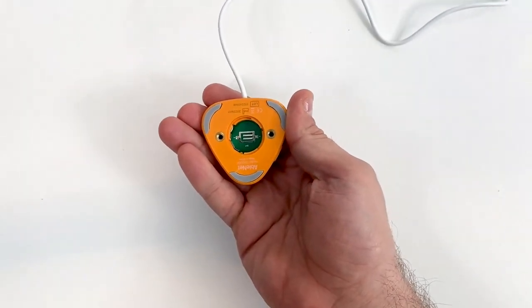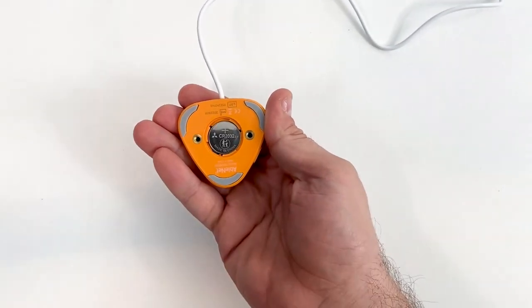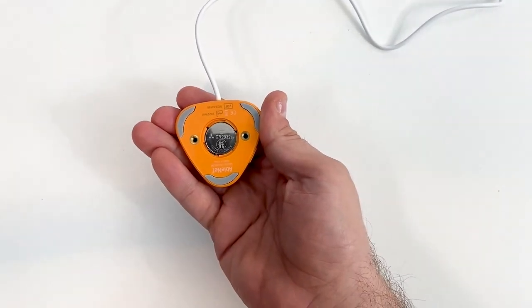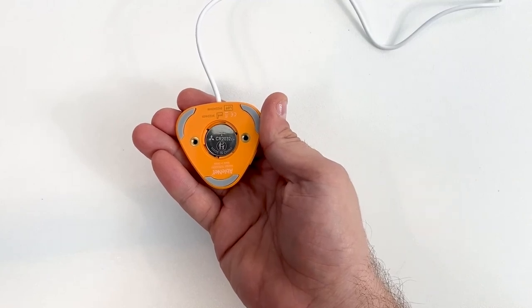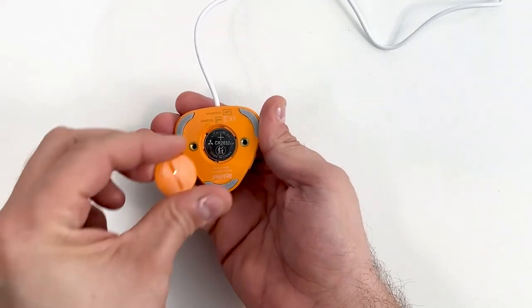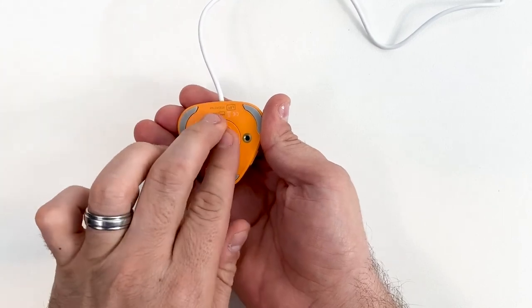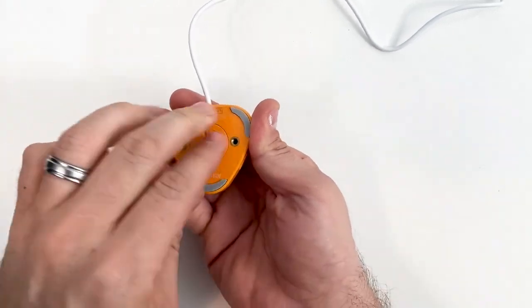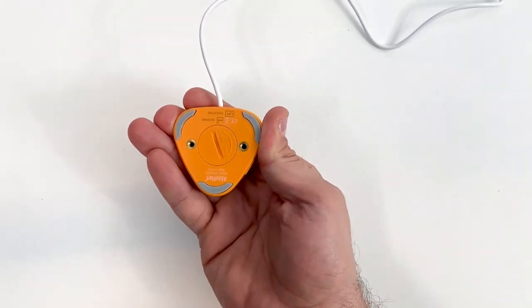Place a new CR2032 battery in the battery compartment with the negative side facing the switch and positive side facing out. Replace the battery cover, then twist counterclockwise until it stops.